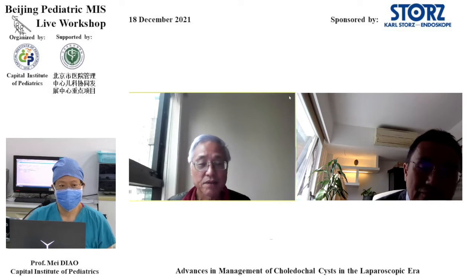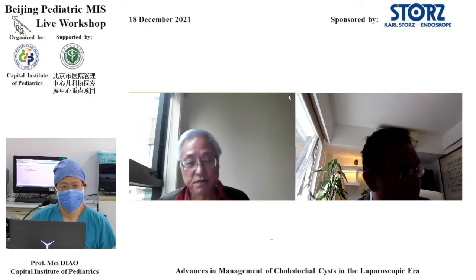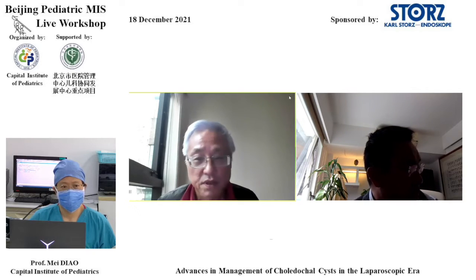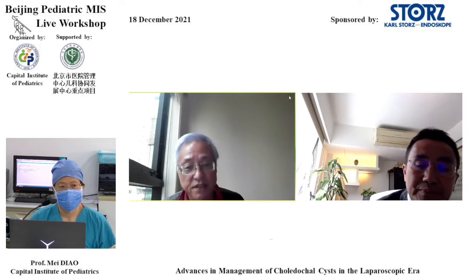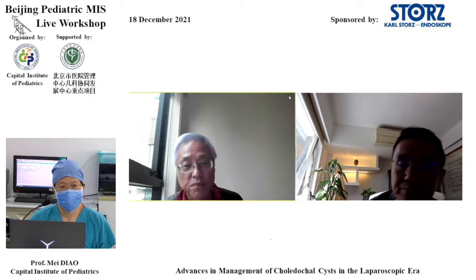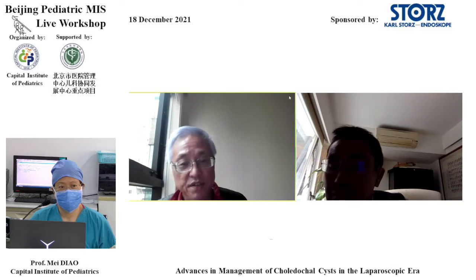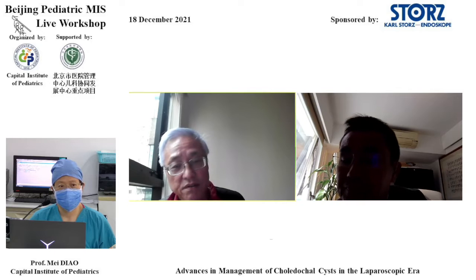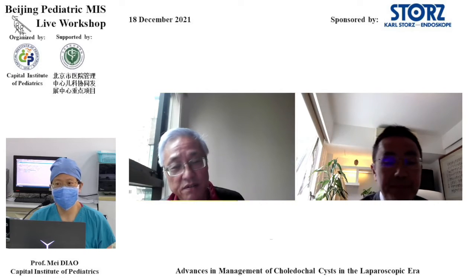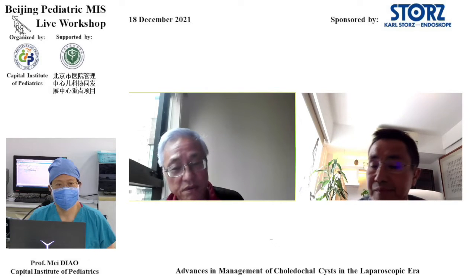The follow-up on my question previously, I asked about the suturing from conventional laparoscopic choledochal cyst excision. You clarified that if it was 3-port, you would suture. You would start the suture at 6 o'clock, and then you would go round to 9 o'clock, and then 6 to 9 and 6 to 3 separately.